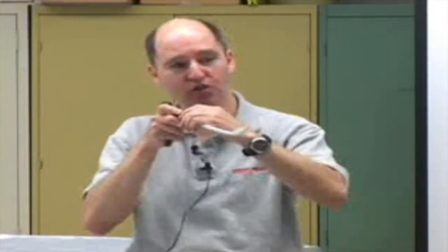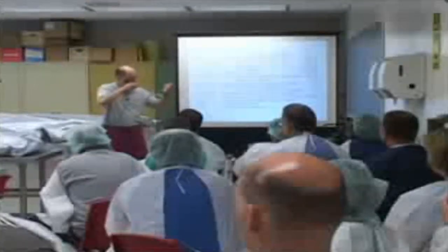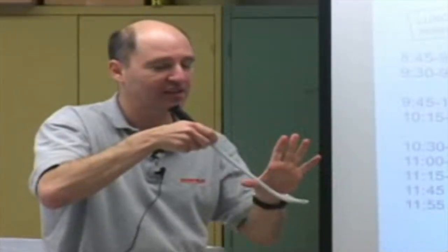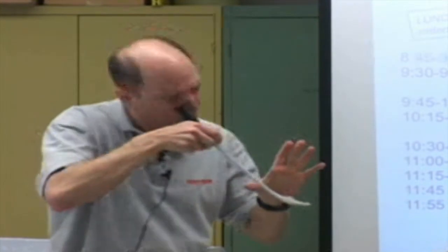Check the setup first: make sure the lens is clean, the tube is seated on the hub correctly, and it's set right. Then do your laryngoscopy, get into position, identify the tip — it's off the mucosa — rest it against the dentition and upper palate, go to the eyepiece, and navigate through.